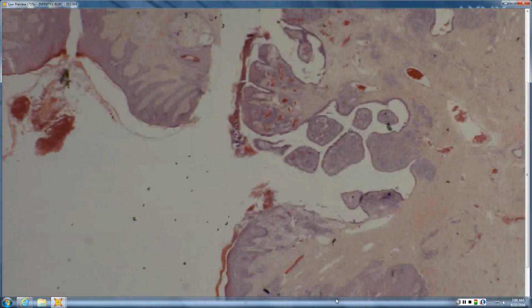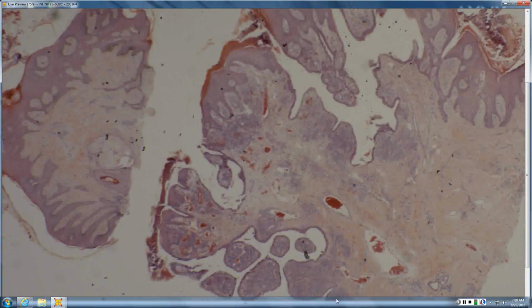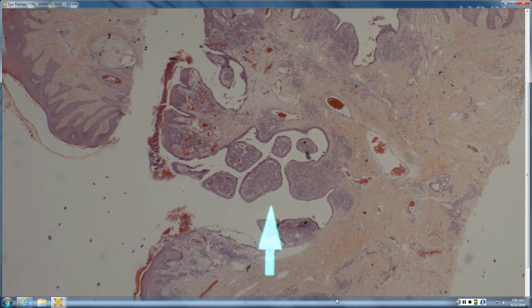Okay, so this one is syringocystadenoma papilliferum, or SCAP for short. And sometimes they're a little bit better developed. This one is still enough to get to the answer, because you get these fjords and fronds, these little seemingly intraluminal papillations. And it appears that it's something you can almost slide into, and it's very superficial. It's probably on the scalp.